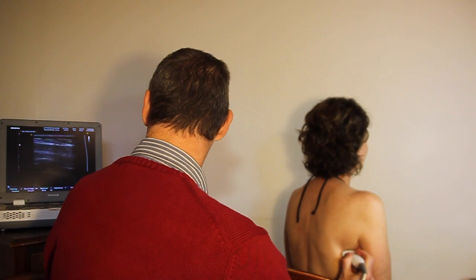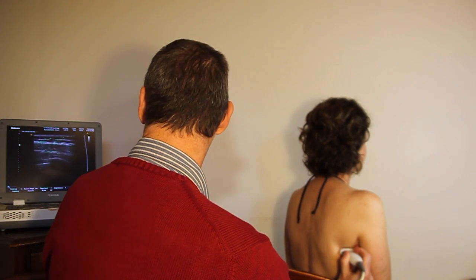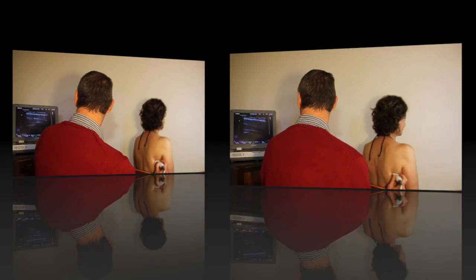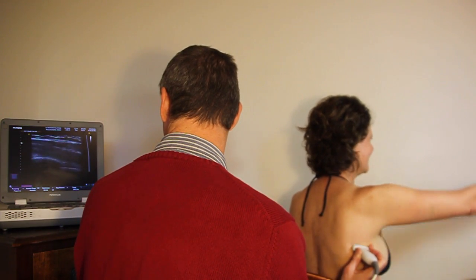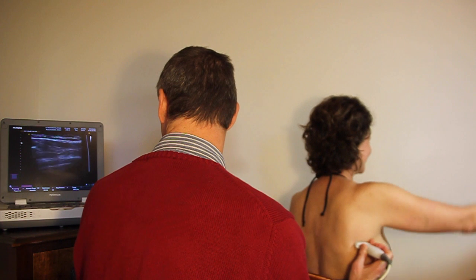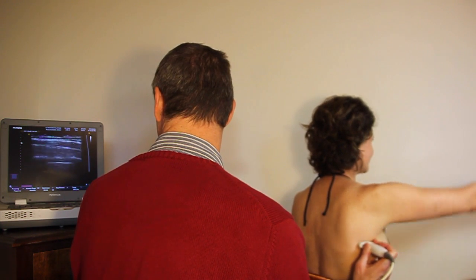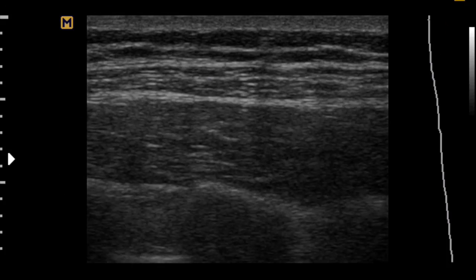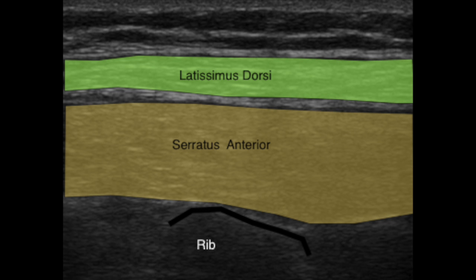The serratus anterior muscle is seen best about 10 cm underneath the axilla. Now assess the degree of thickening during shoulder elevation, noting at which stage of the movement serratus anterior activates. Here we see the serratus anterior muscle sitting underneath the latissimus dorsi muscle and overlying the ribs and pleura.